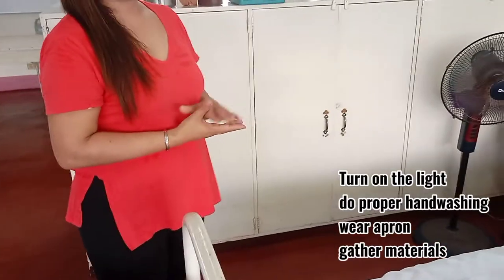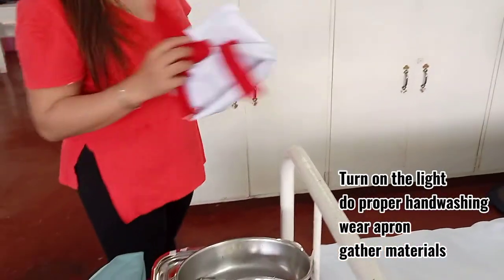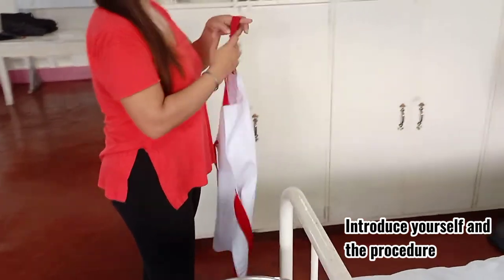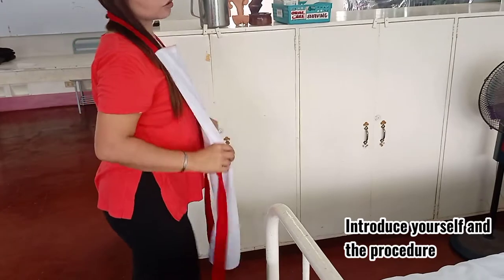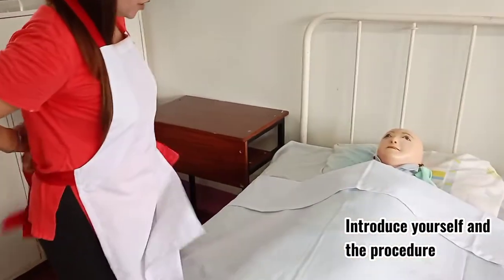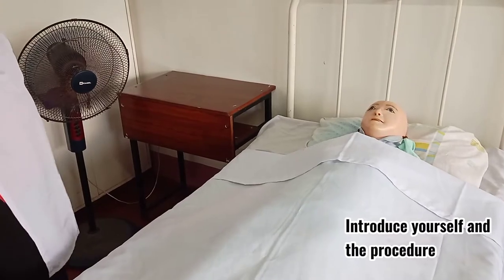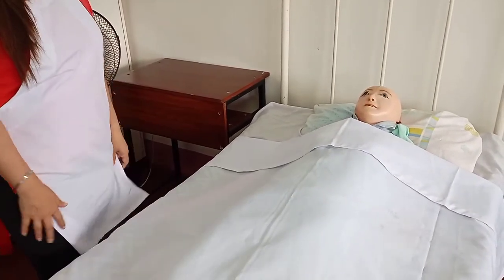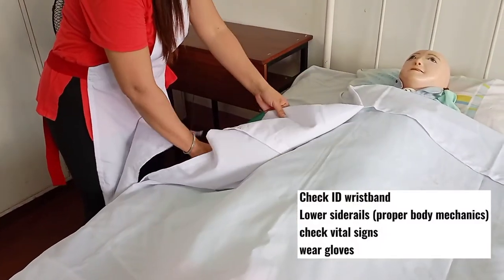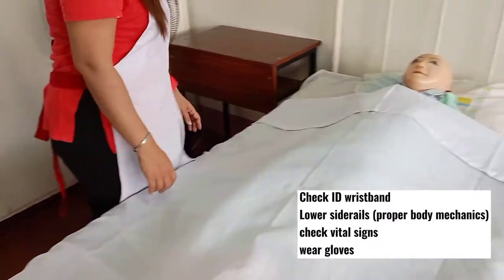For the procedure, turn on the lights, then do the proper hand washing. Wear the apron, introduce yourself to the patient, and explain what procedures we are going to do. Good morning ma'am, I'm going to render you the proper catheter care to prevent scarring and any skin breakdown. Check the wristband of your patient, lower the side rails using proper body mechanics, then check the vital signs.